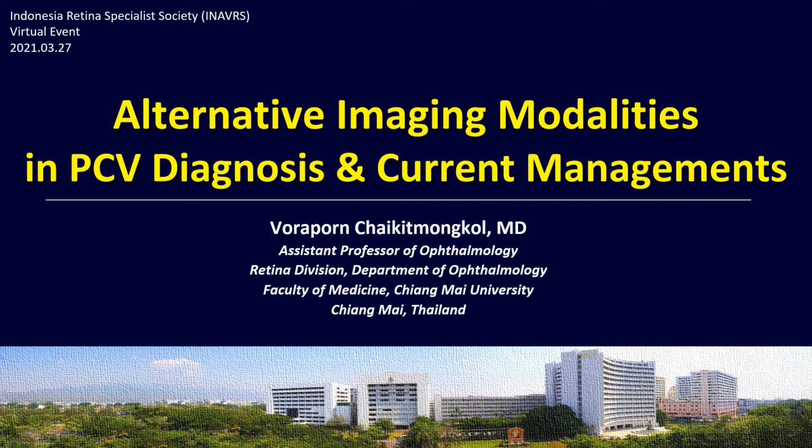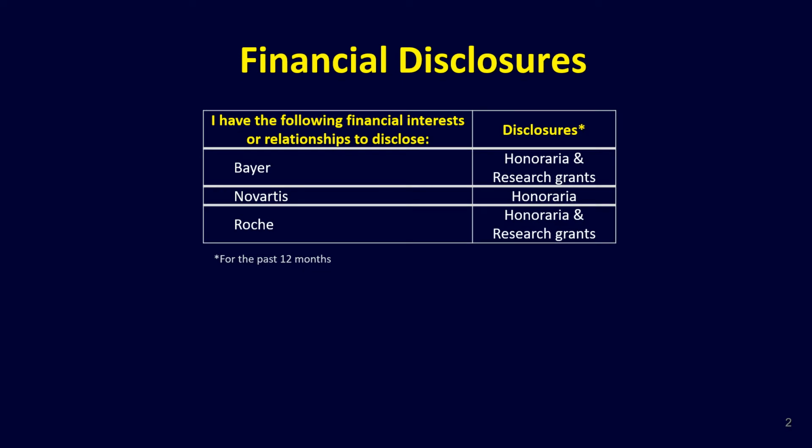Today I'd like to talk about alternative imaging modalities in PCV diagnosis, especially when ICGA is not available, and the current management of PCV. And here's my financial disclosure.